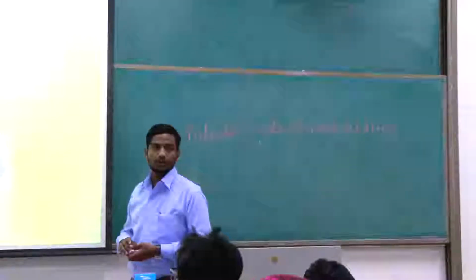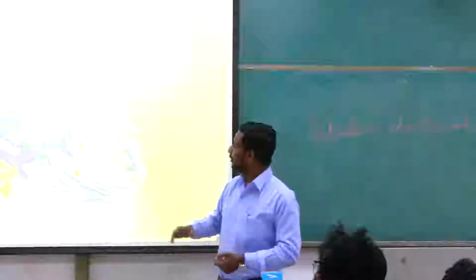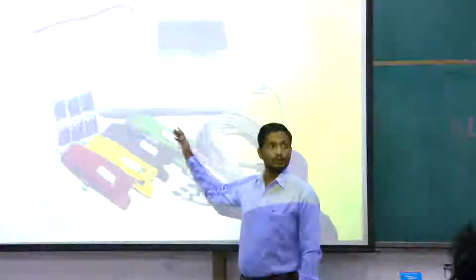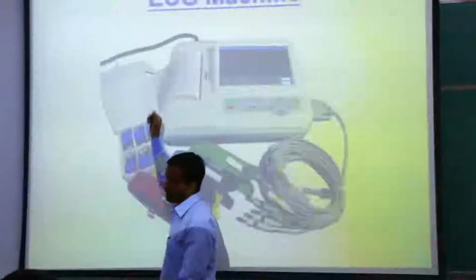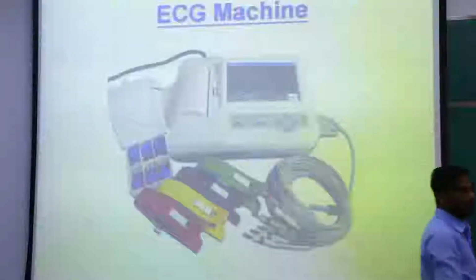Right? Okay, now once we know about the ECG, keep in mind that this ECG machine was discovered a long time back. Einthoven was the main person to start talking about this particular machine. And now we know that ECG machines come in many different forms, but here you can see that they have two very important things we need to know. Number one, different electrodes, and number two is the paper of the ECG. So these are two things where we doctors should be very careful.